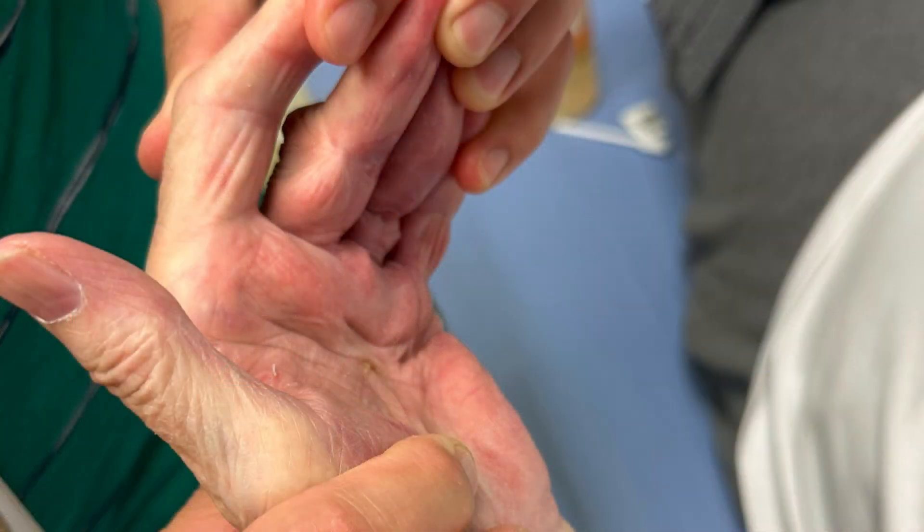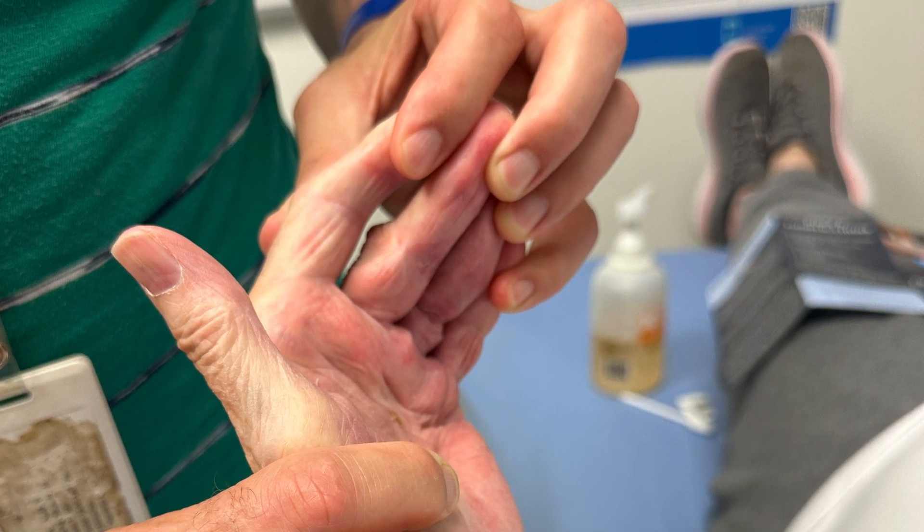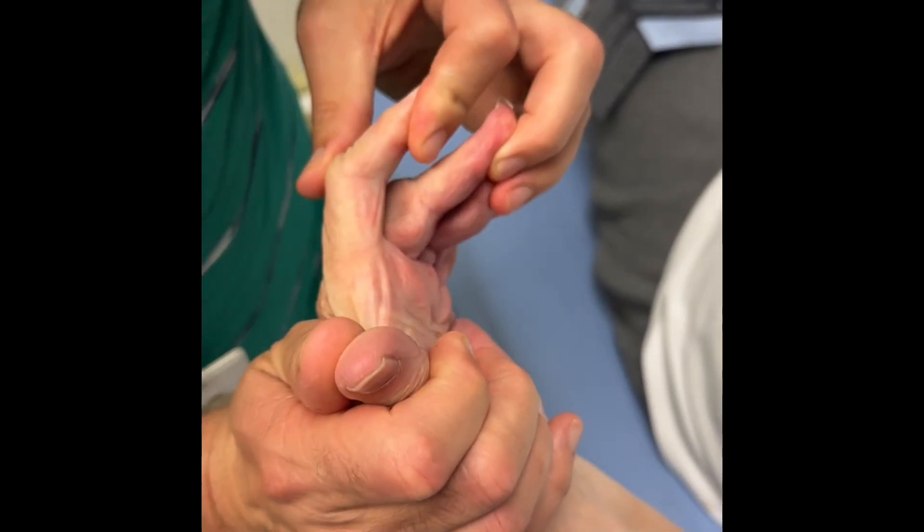We then do digital blocks and manipulate the fingers — you can hear all the scar tissue breaking as the fingers are mobilized open — making sure to stabilize the joints so that they don't sublux or fracture.